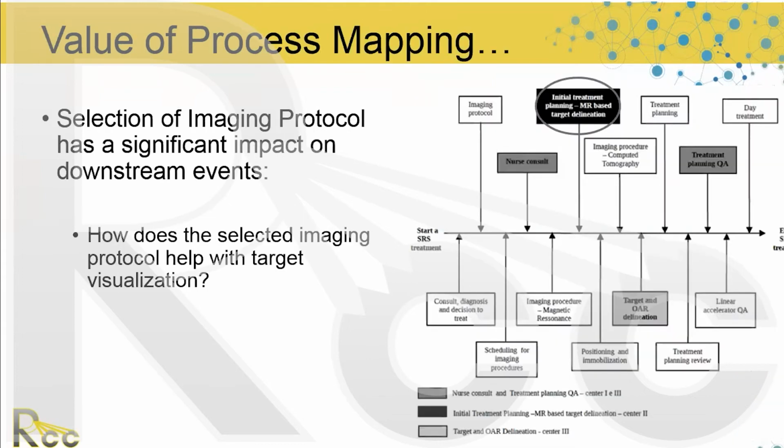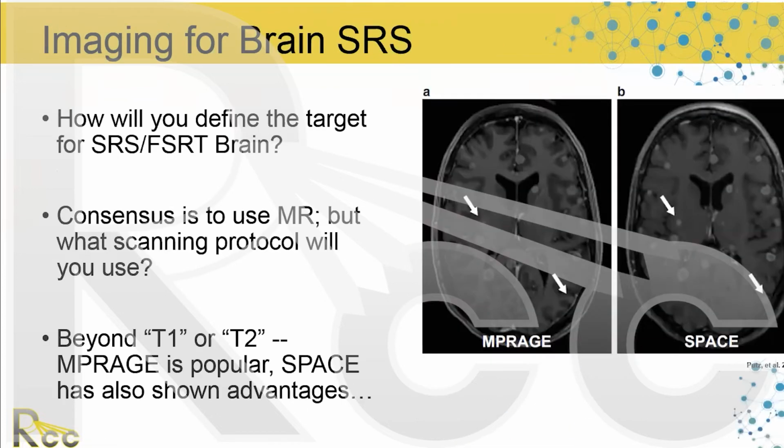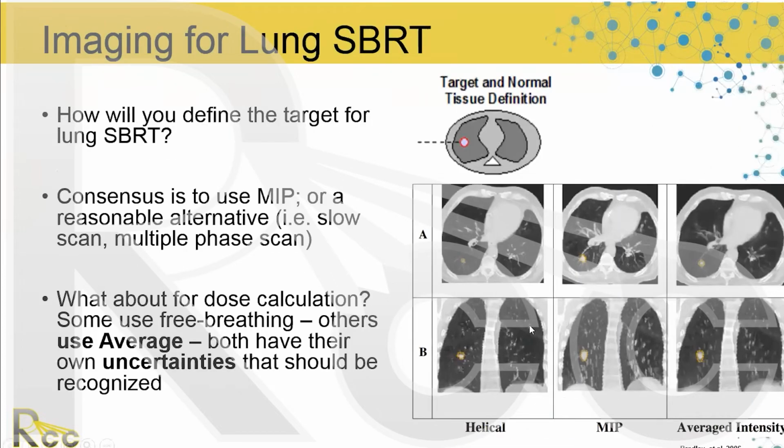So Peter, there are a couple of questions before we move on. Someone was asking why for liver cases would you use the minimum intensity projection, while for lung you would use the maximum intensity? So it's about the contrast. In the liver, the contrast is flipped. The lung tumor shows up as white, as a high density object.